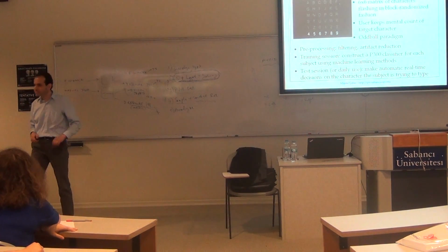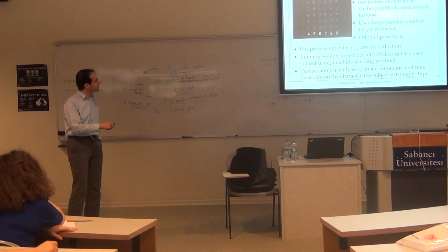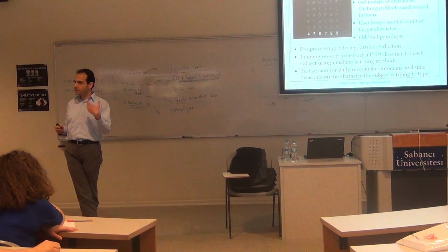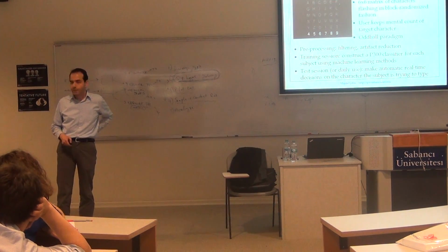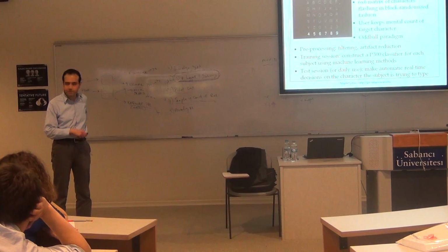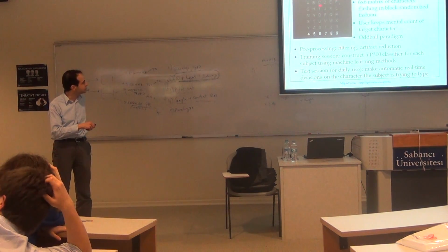Once you choose the row, for example, the row is clear to me, but then how do you determine which letter? Right, so basically think about it this way. First let's think about the problem of detecting the row. There will be, let's say, 6 pieces of signals, and one of them will be detected as the row. Let's say you detected row 1. And then you do the same for columns. Let's say your algorithm chose column 3. That means that if you chose row 1 and column 3, the person is trying to type C.